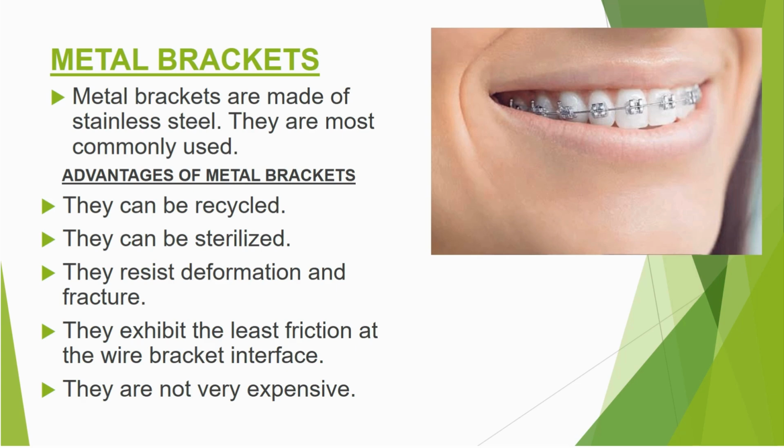First, the advantages of metal brackets. They can be recycled and sterilized. They resist deformation and fracture. They exhibit the least friction at the wire bracket interface. They are not very expensive.